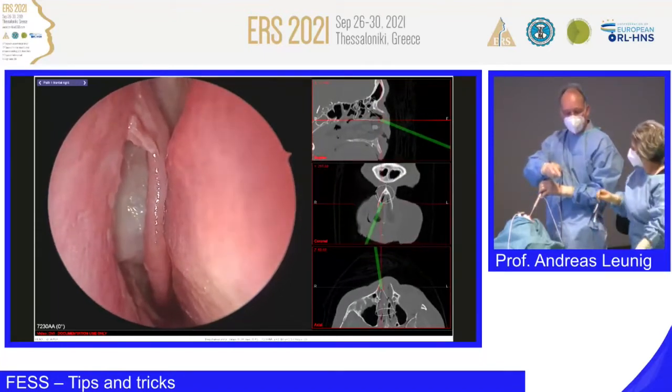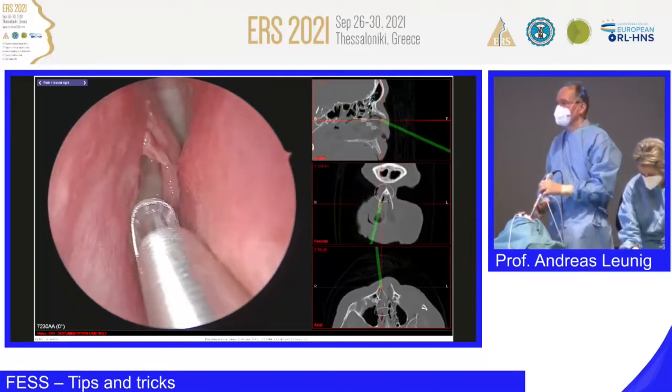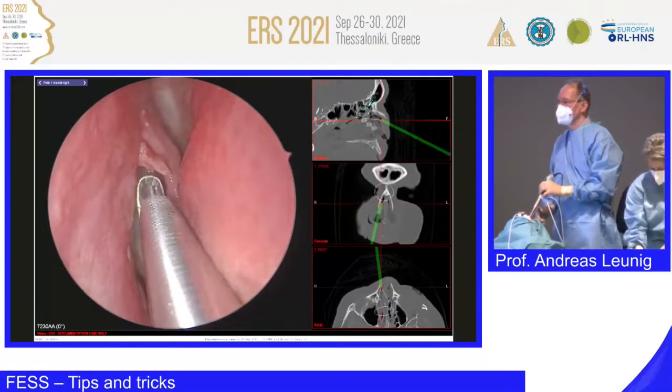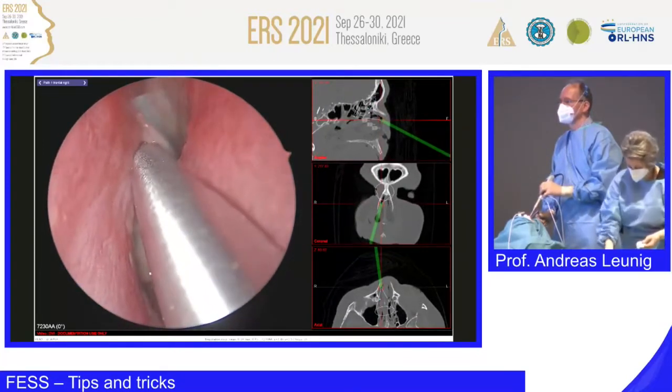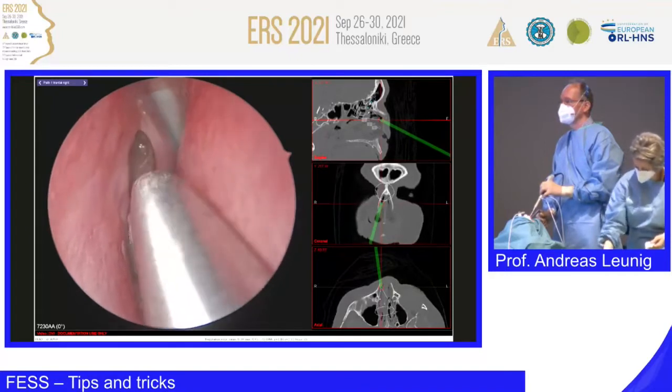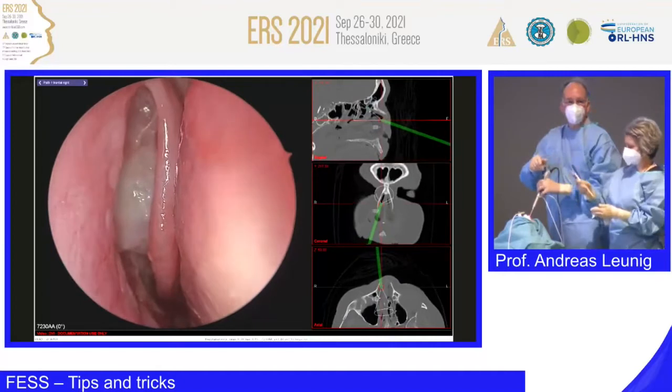The swinging door technique is very, very helpful when you have a hypoplastic maxillary sinus, because there is a very high risk of entering the orbit. So in this case, I would only use this technique, and in other cases, it depends. So this is the so-called infundibulotomy.